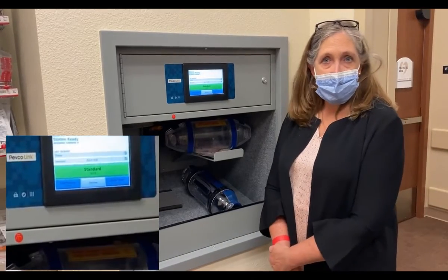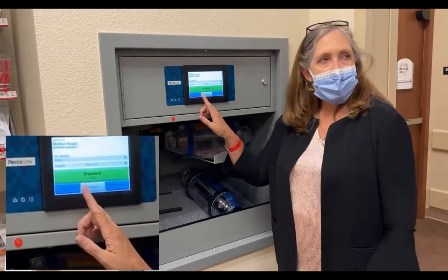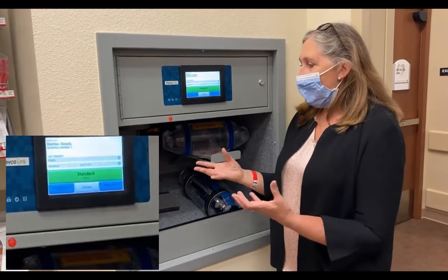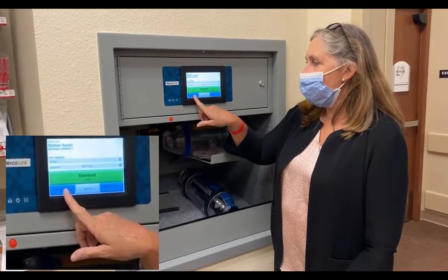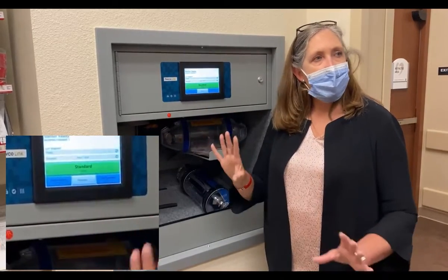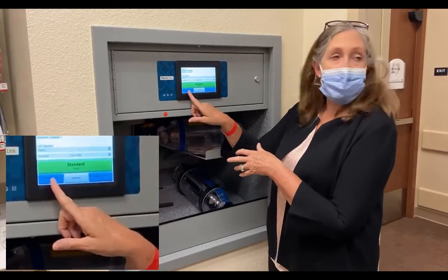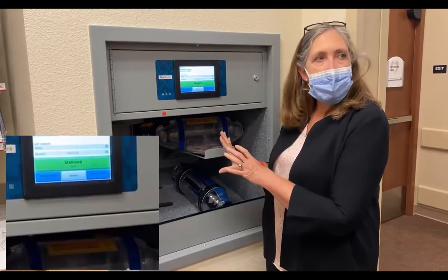Another useful button for clinical staff, the empty carrier request. So for instance, on a nursing unit, you may send a lot of labs in the morning, and you may send them out in kind of rapid succession, and you may wind up without carriers. You can request the empty carrier, and that tells the system that you need a carrier. The next empty that someone puts into the system will come to you. So if you really are out of carriers, this is how you call for one. This is how you send empty carriers if you have too many.